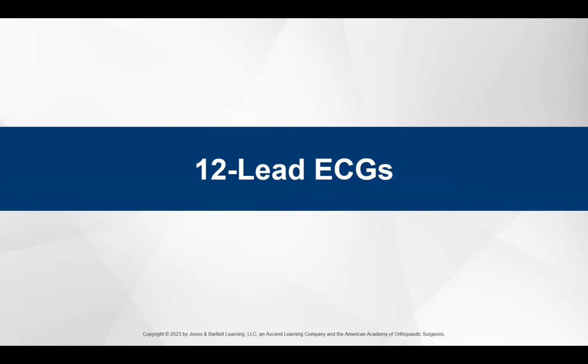All right, so we're doing 12 leads. We have not talked about 12 leads yet, so we need to focus on this. What do we get with 3 lead? Do we diagnose anything with 3 lead? Not really. Base rhythm, that's it. We understand base rhythm off of 3 leads. When we get into 12 leads, we're identifying injuries, we're identifying those sprinkles on top that we haven't got to. We haven't even talked about things like bundle branch blocks and some of those specifics. We're going to get into those now.